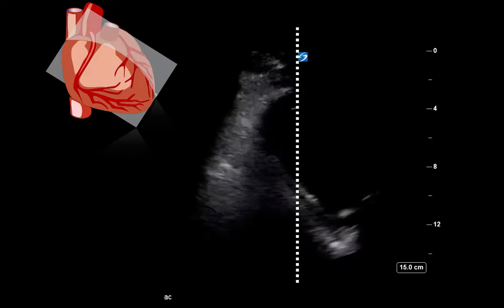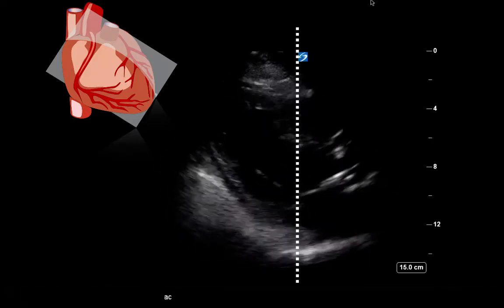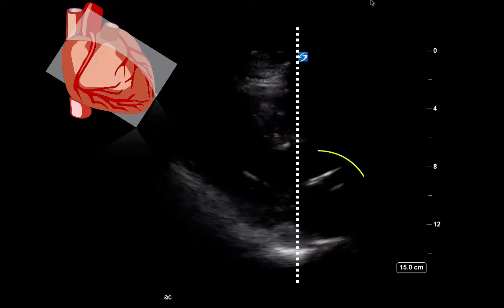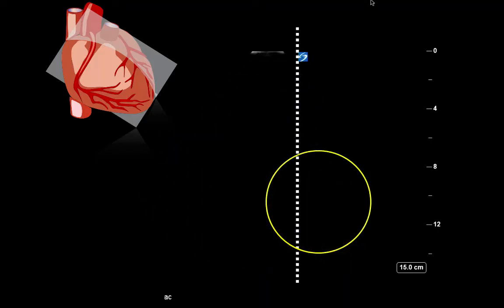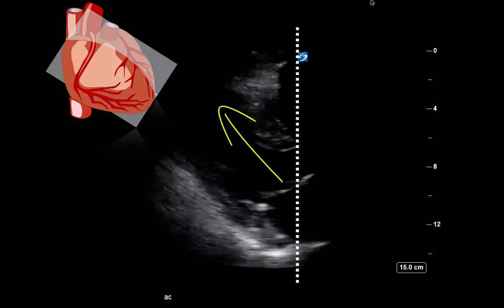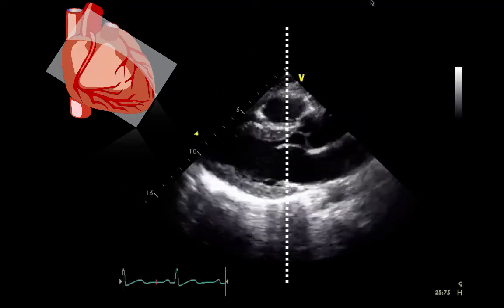This is also true for the parasternal long axis. We can see here that the rocking has led to an off-axis image initially, but then corrected to bring the mitral valve roughly in the middle of the screen. The LV is pointed up here, and I can tell you this view is likely acquired very low on the sternum. A more conventional view would be this.